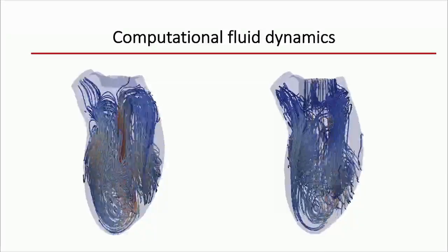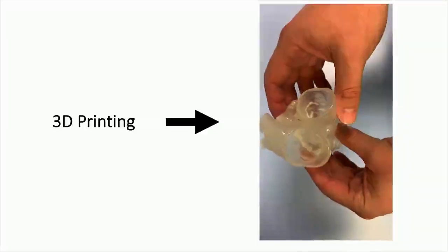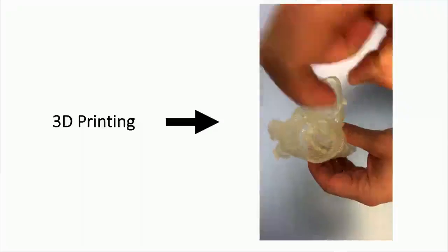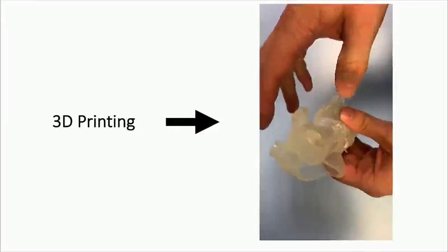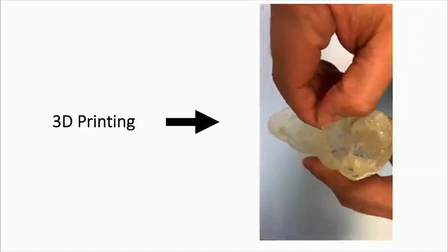It is also our practice, where possible, to obtain some 3D printing of these cases, and GE are also able to offer us some 3D prints, which allows enhanced visualization and manipulation of these models to see exactly what the specific anatomical considerations of a case are.